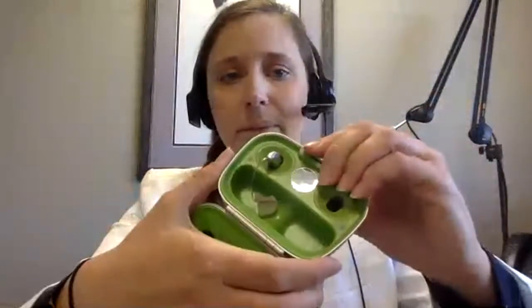If you have a rechargeable hearing device, obviously, I don't want you going in there trying to change that battery. Just take your device, put it in that charger, right? And then just take it right back out, right? Make sure it's plugged in or it has a power pack on there. That way we get that hard reset of the device. Again, most of the time, especially for my rechargeable patients, that'll be an easy fix.